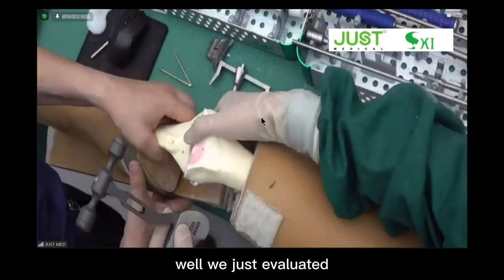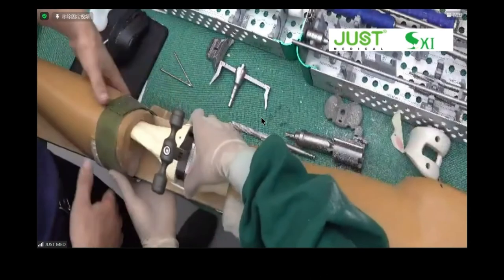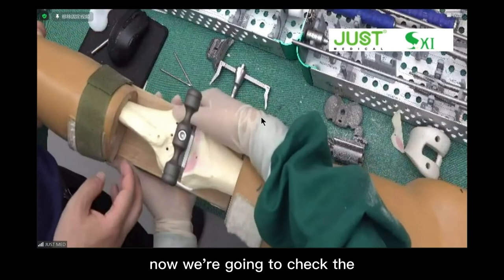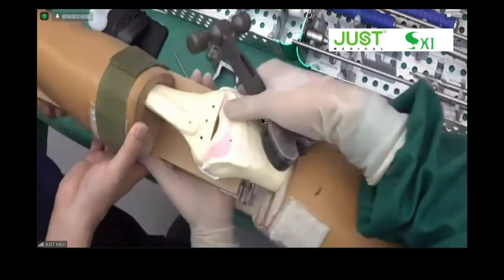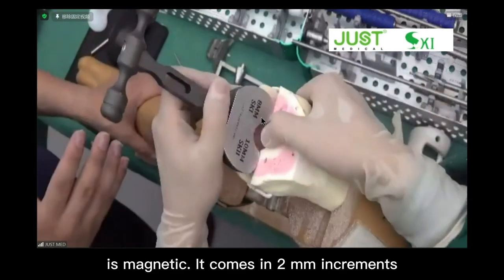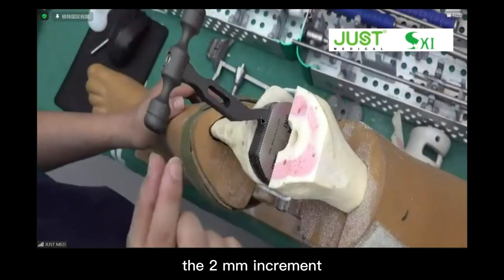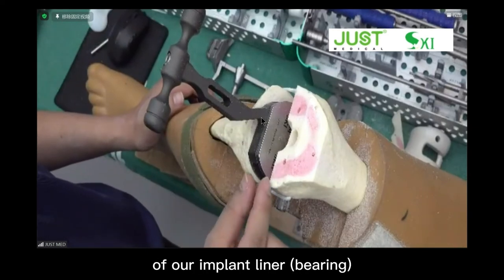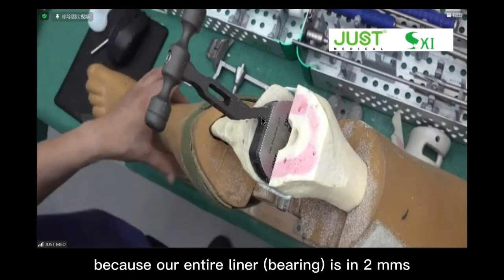Well, we just evaluated the extension gap. The extension gap is all right. We can do it again. Now, we're going to check the flexion gap. The modular surface of the spacer block is magnetic. It comes in 2 millimeter increments. The 2 millimeter increments just correlate with the thickness of our implant liner, because our implant liner is in 2 millimeter increments.